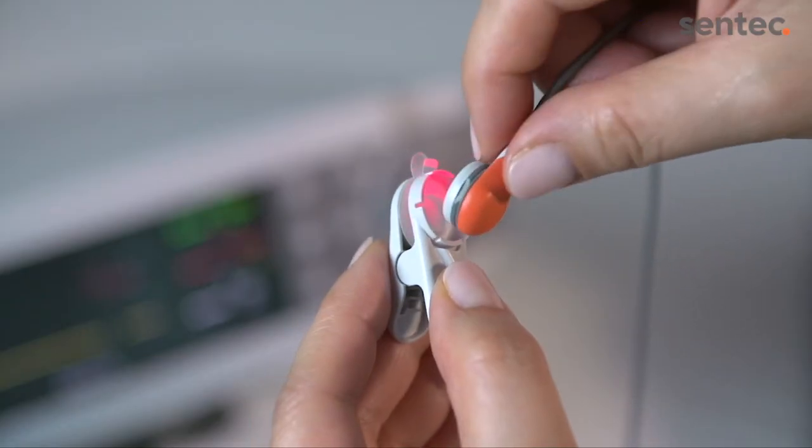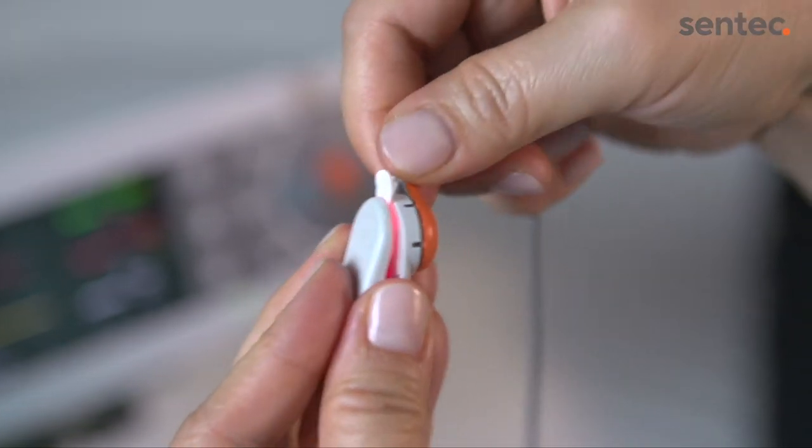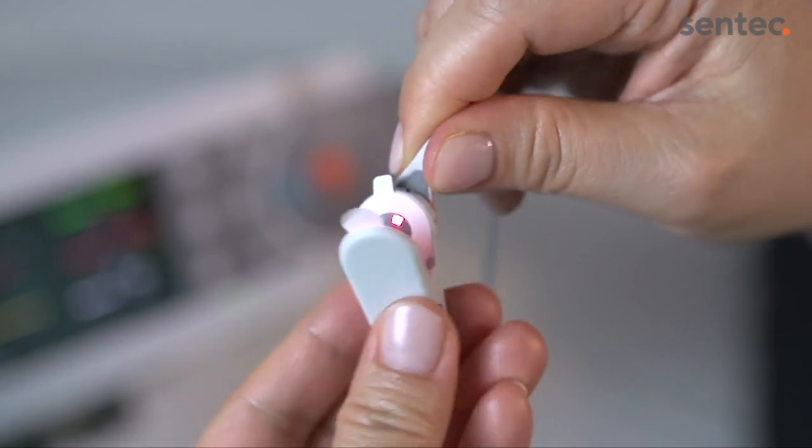Click the sensor into the ear clip's retainer ring. Check that the sensor can be easily rotated to ensure it is snapped in correctly.